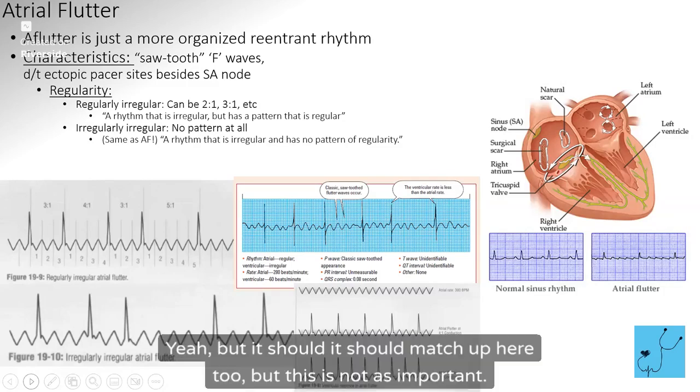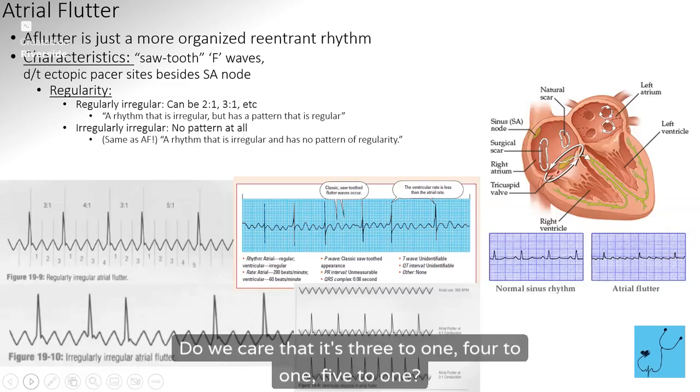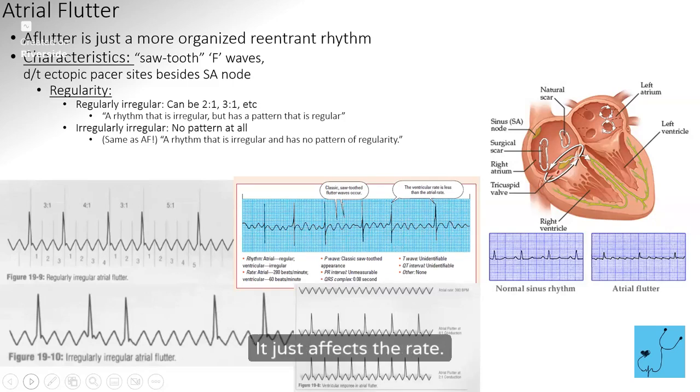It should match up here too, but this is not as important. Do we care that it's 3-to-1, 4-to-1, 5-to-1? We really don't care. It just affects the rate. So don't worry so much about that. It's a flutter or it's not. That's really all we care about.